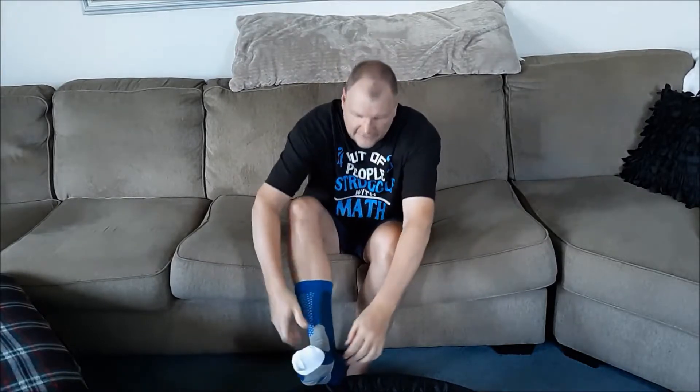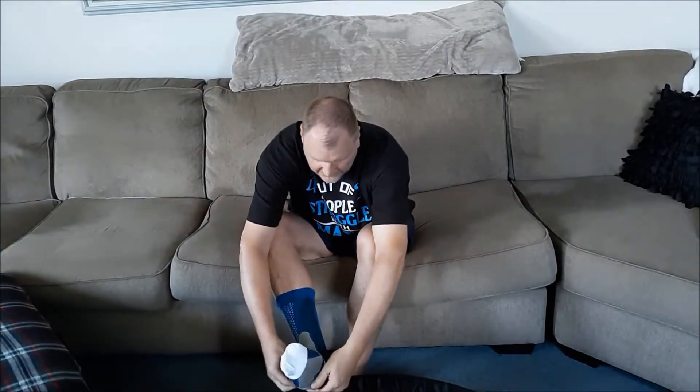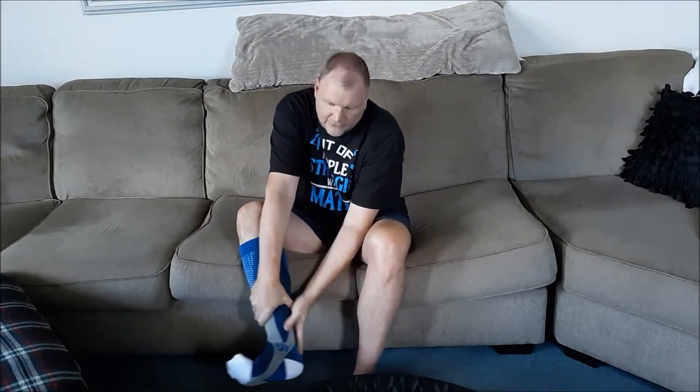These are definitely tighter than those black ones. Maybe once we get up here a little bit they'll release, but darn. So now they just pulled — we'll try to pull them up over top. So these are not going to go over the calf or over the knee for me, but they are pretty tight.